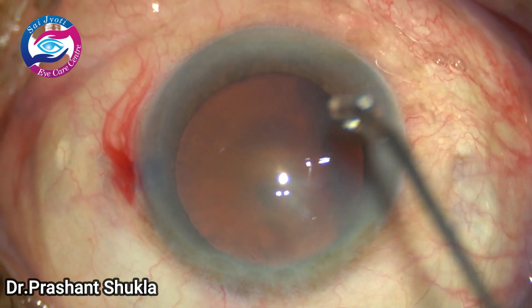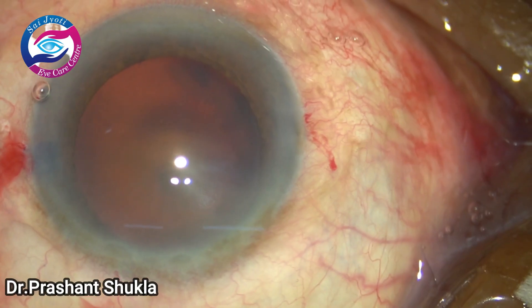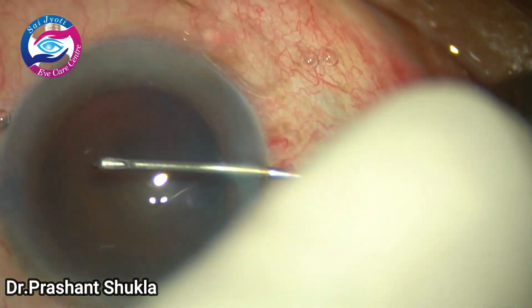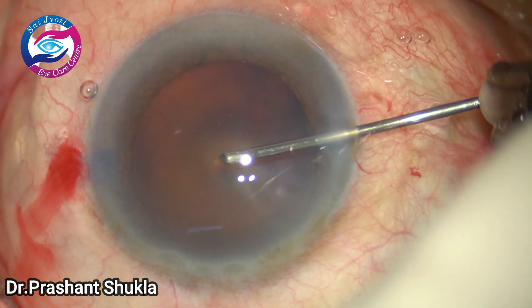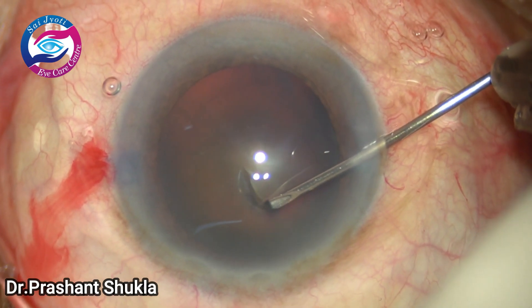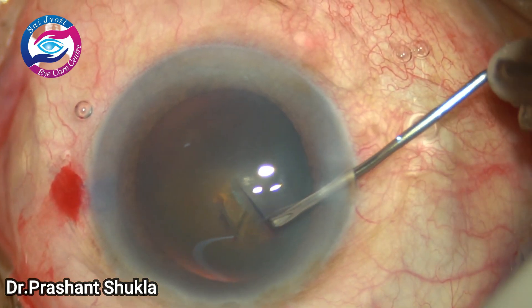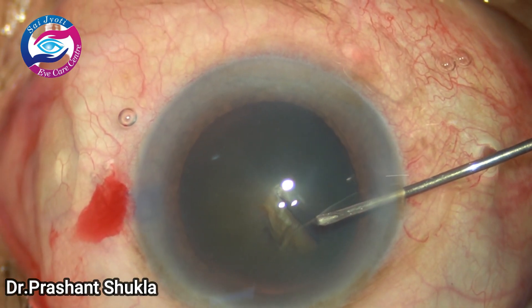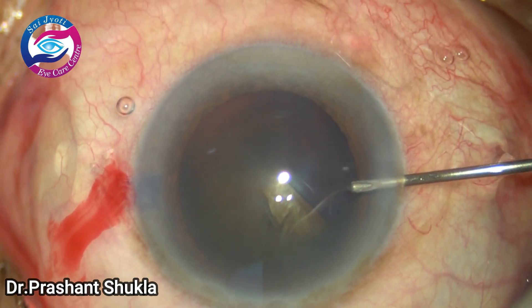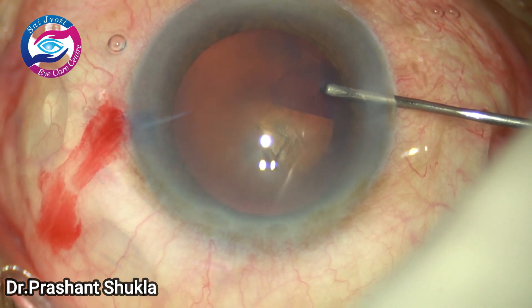Some HPMC has been layered over the cornea to aid in visualization. This is how you take a bent needle cystitome to raise a small flap, puncturing right in the center of the anterior lens capsule. You then raise a flap — a C-flap or whatever flap you like — and move it gradually and slowly over the nucleus in a continuous curvilinear fashion.